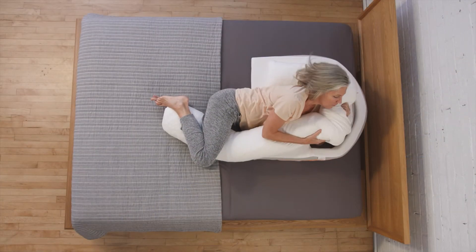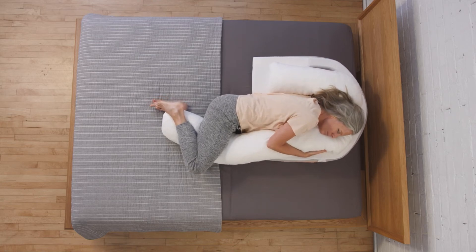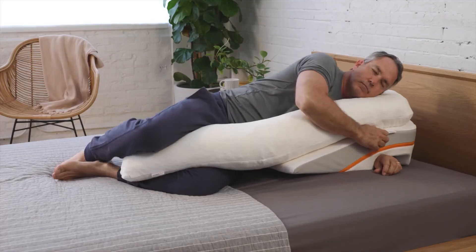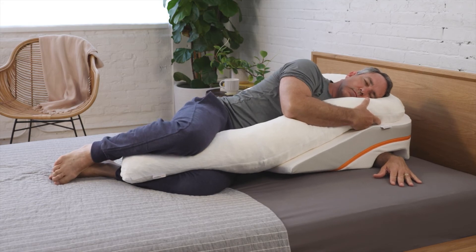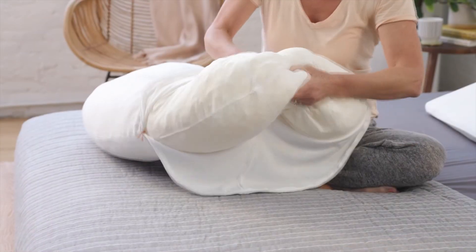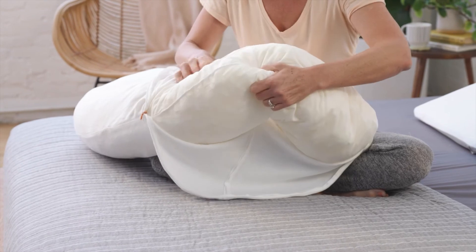Our final positioning tip involves experimentation with the therapeutic body pillow. Pull the body pillow snug to your neck and exaggerate your knee bend. Then pull the body pillow between your knees or upper thighs. This position should help anchor you at night to prevent sliding. If you need to adjust the stuffing height between your knees, you can pull the shredded memory foam stuffing apart to create a nest for your knees or add more support where you need it.